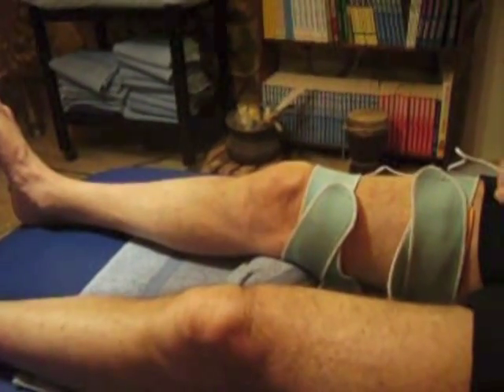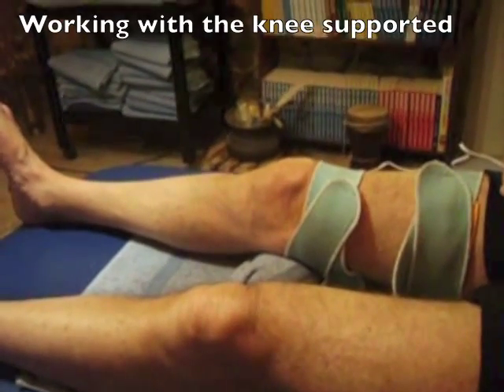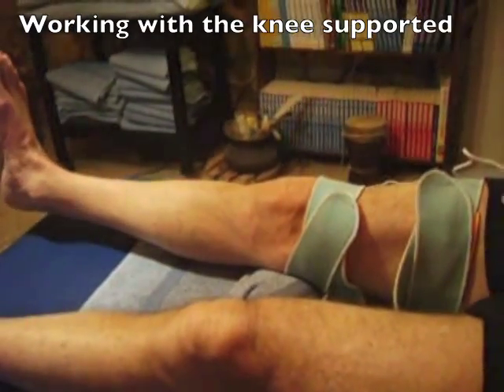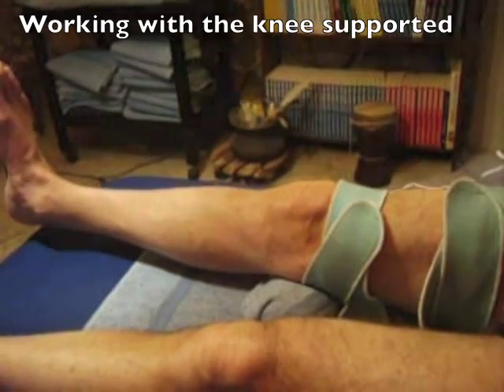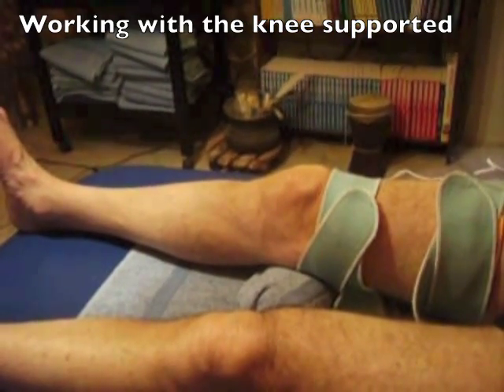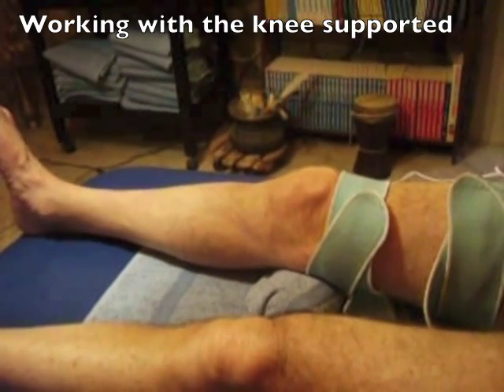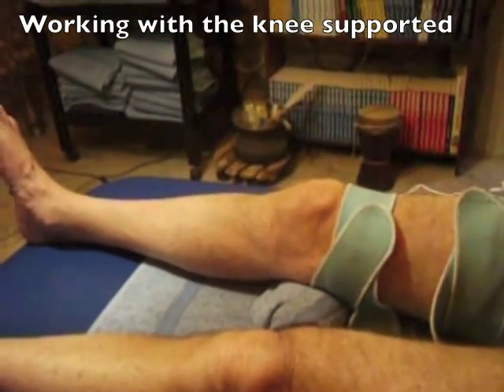A progression from working with hyperextension of the knee is to extend the knee over a firm support so that the heel is lifted up through about 30 degrees of movement at the knee. This can be made more difficult by adding a weight over the ankle to create a strengthening element in the VMO work.